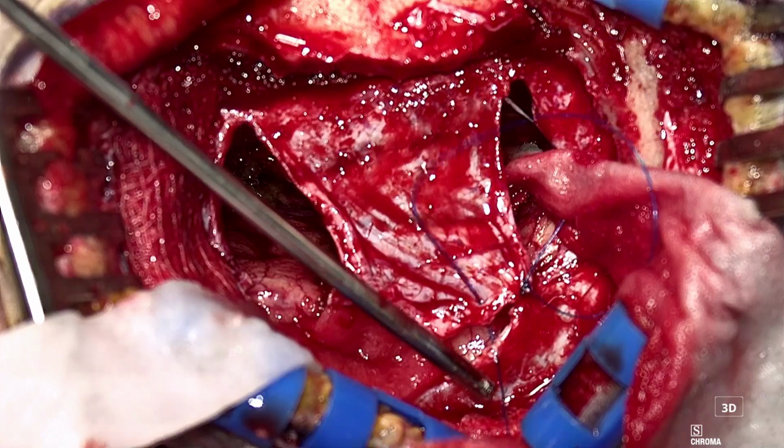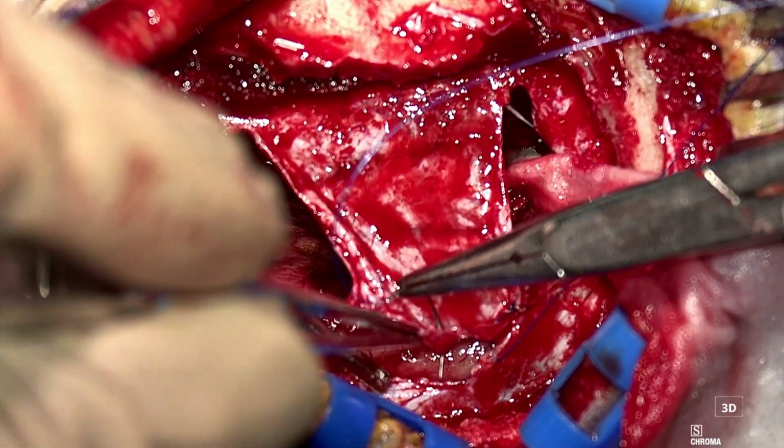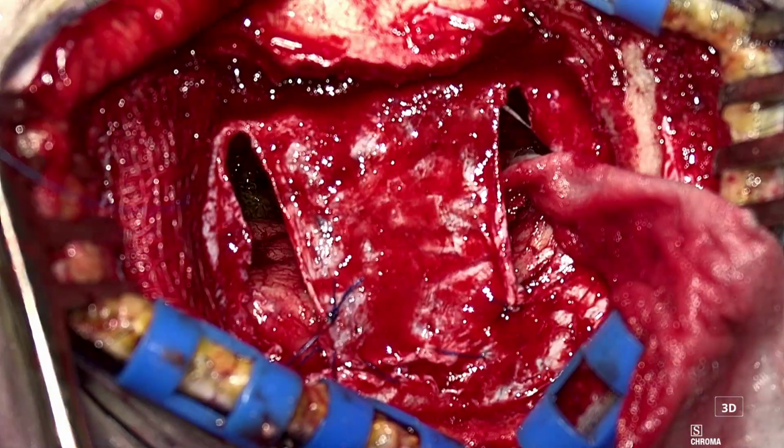The dura was closed using prolene sutures, and closure was done in layers.